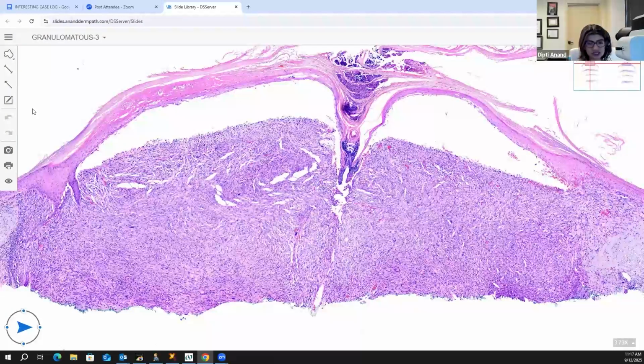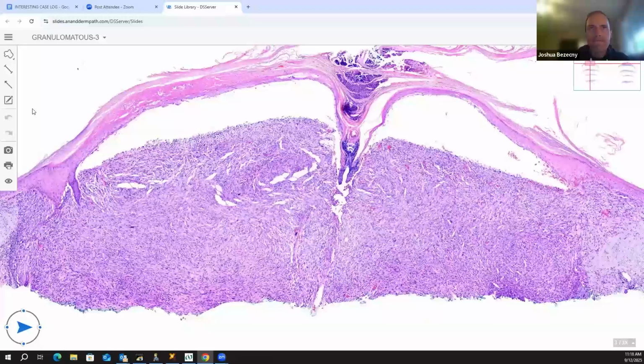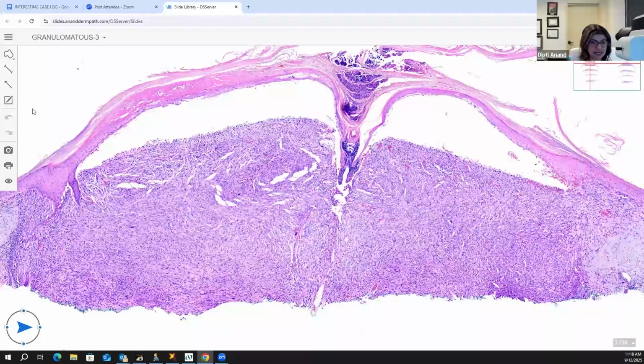Okay, the other question they can ask you on this is the 70-year-old man with this lesion on the scalp with strong staining for smooth muscle actin, negative for desmin. They give you multiple choices and they also put a leiomyosarcoma in there. What would you pick? AFX or a leiomyosarcoma? Remember, this lesion is SMA positive. I don't know the answer to that one. You will still pick an AFX.